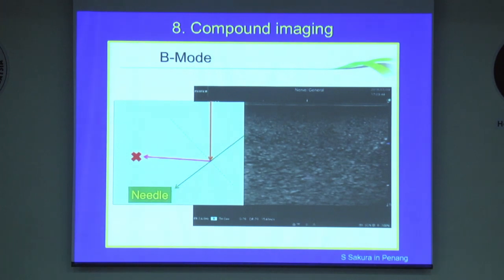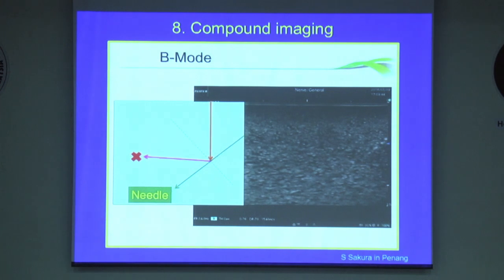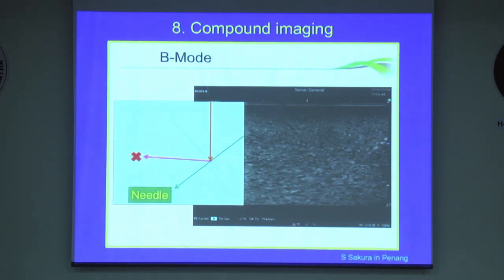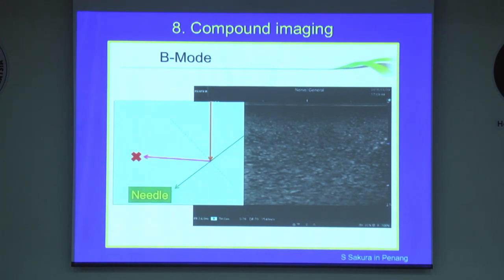As ultrasound technology has advanced, new imaging technology modes have been developed. These include compound imaging and beam steering. Traditionally, transducers send signals in a single line of sight — perpendicular from the probe head — and listen for the echo.